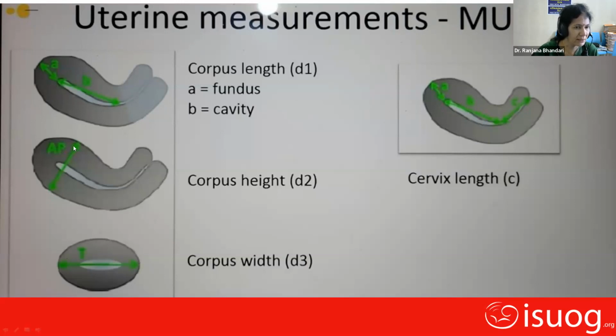The widest portion will be taken, just like the endometrium, you have to take the widest endometrial canal, then you don't have to do it here and there for measuring anterior and posterior. In the same image, you have to measure the anterior as well as posterior thickness of the myometrium. Because many times there is asymmetry of the anterior and posterior layer, but in the same image we have to calculate it. The cervical length has to be calculated separately.